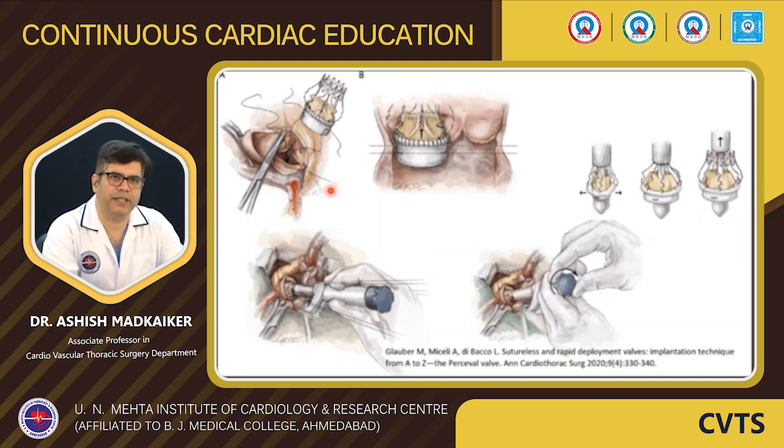Now again, one question here: as we saw, sutureless means not completely sutureless, and we need to take a maximum of 3 stitches, not more than 3 stitches, to place a sutureless valve. The second question is, why sutureless? We can obviously see that it has significantly reduced the time of taking stitches all along the annulus and then tying them. So indirectly it has significantly reduced the aortic cross clamp time and the cardiopulmonary bypass time. This is very important in patients who are at high risk, so obviously it is making surgery a bit safer.